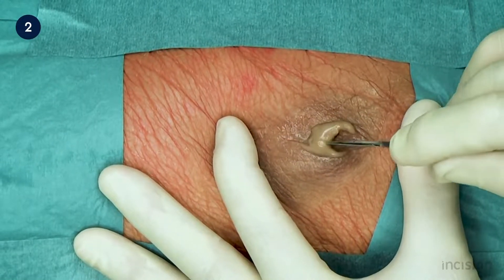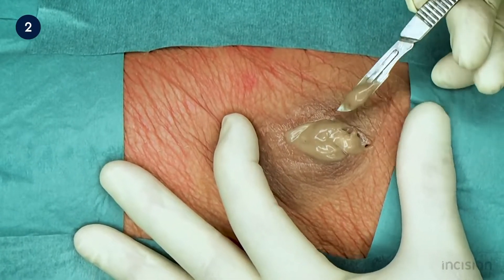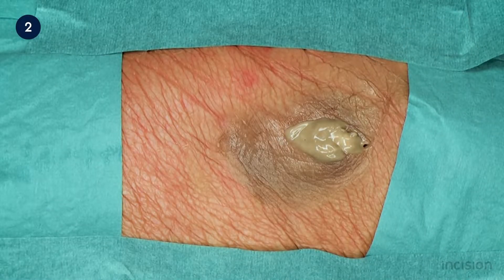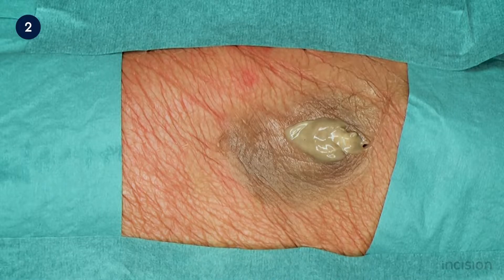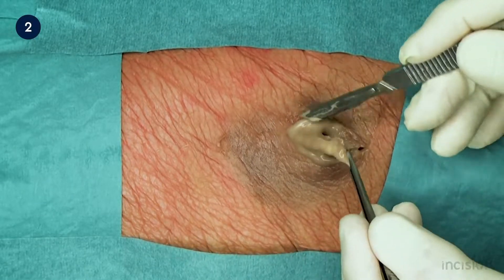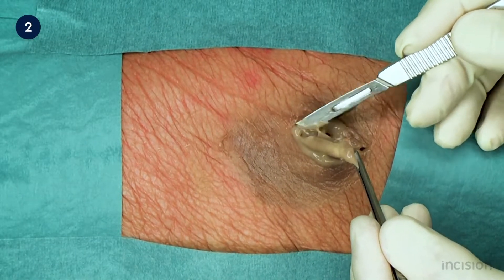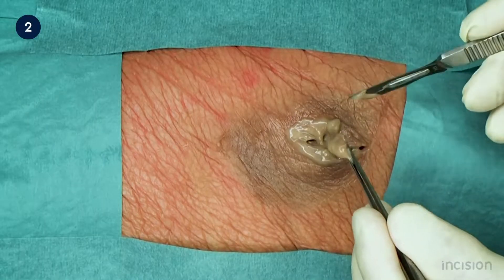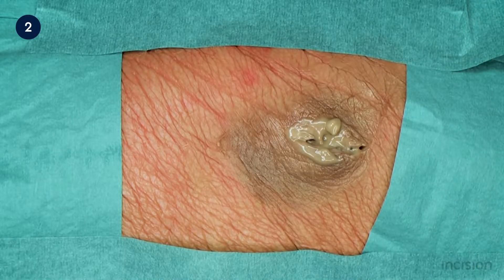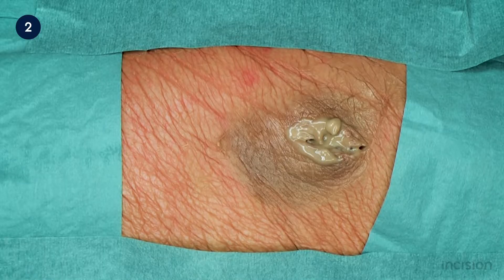Depending upon the size and shape of the abscess, a number of types of incision, including simple stab or linear incisions, can be placed. Using forceps, the roof of the abscess cavity is excised. The defect created should be large enough so as to allow the abscess to drain completely of purulence and prevent premature wound closure.